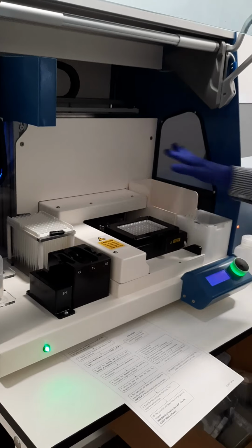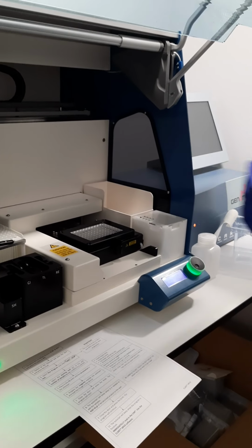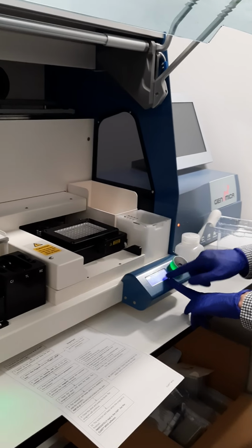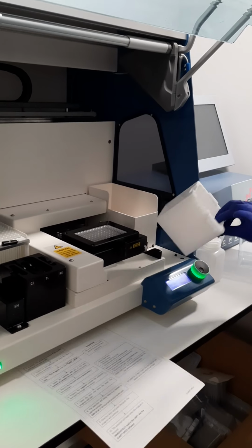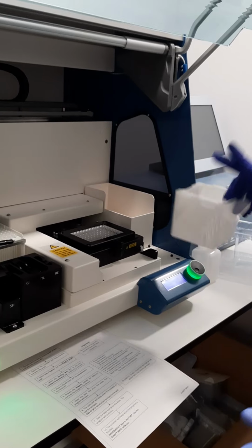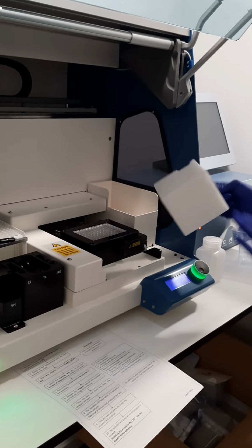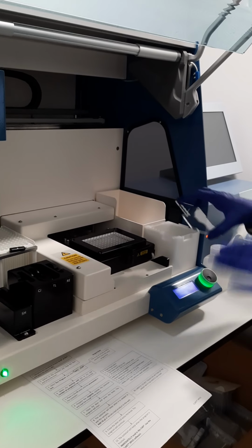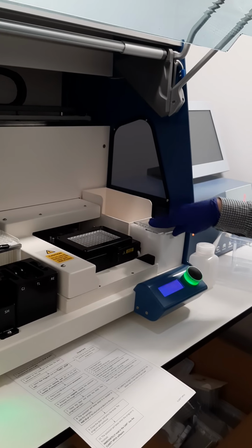Okay, we check the tip basket is this, that it is empty. If we have used it before, we put it in the basket. We check also the waste stream that is here. Here are going to be the liquids, to discard the used liquid, yeah. Okay. Like we will do when the machine finishes. Okay, to clean it when it's finished, but just to check that everything is fine.